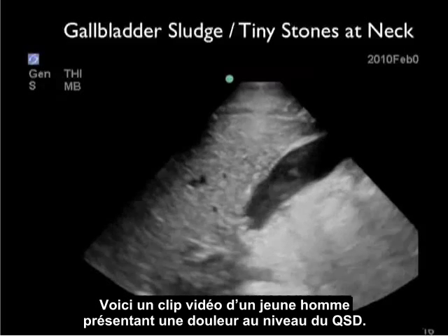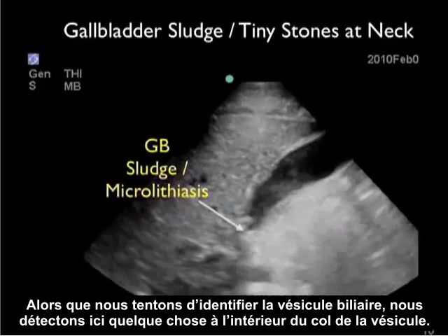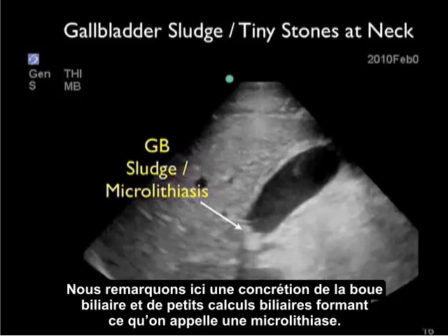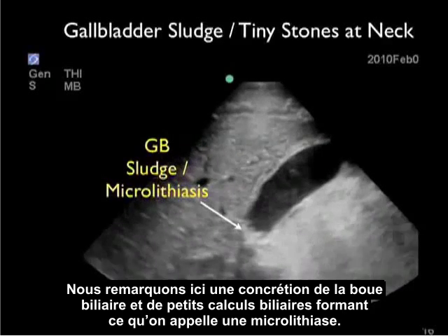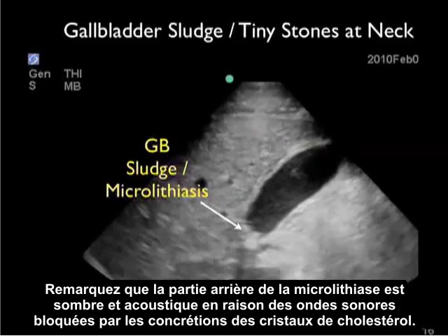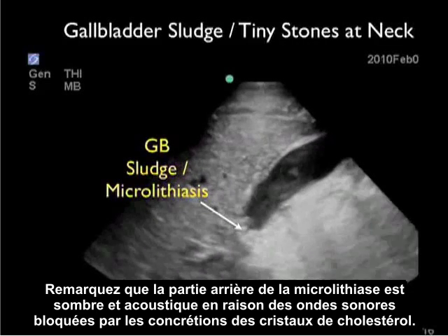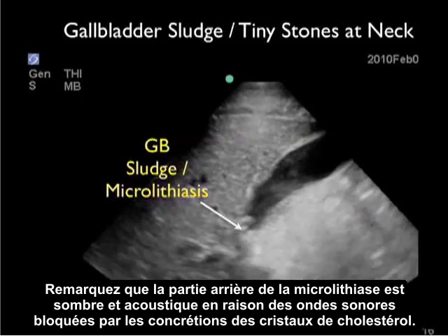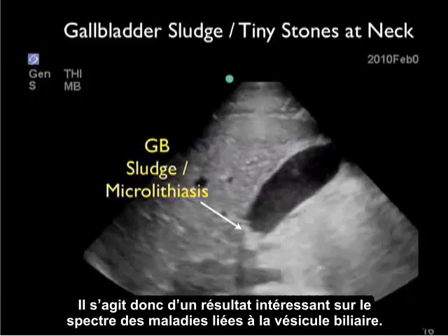Here's a video clip from a young male presenting with right upper quadrant pain. As we look through the gallbladder, we notice a finding within the neck of the gallbladder — a concretion of gallbladder sludge and also tiny gallstones known as microlithiasis. Notice that the microlithiasis has posterior acoustic shadowing due to the blocking of sound waves through the concretions of cholesterol crystals — an interesting finding on the spectrum of gallbladder disease.